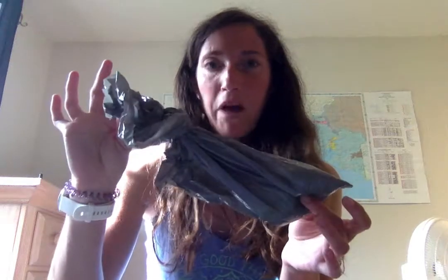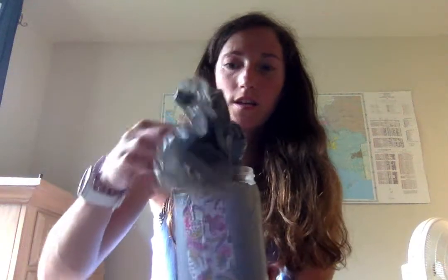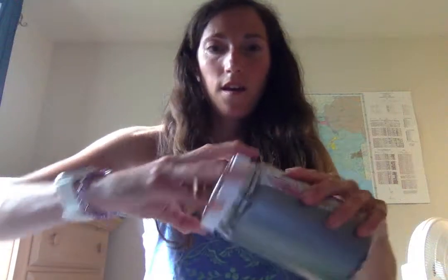And then what I have in here is just one of the gray bags that comes with my ostomy supplies, and then I put some kitty litter in here just to absorb and deodorize a little bit. And then again, I'll either empty into the bag, or you can fold it over the top like that, empty straight into the container, and then tie it up and put a lid on it.